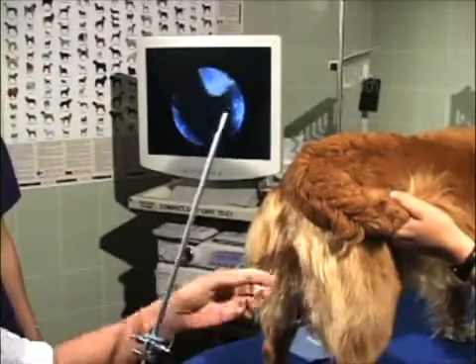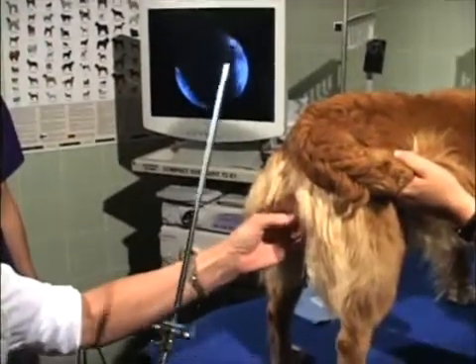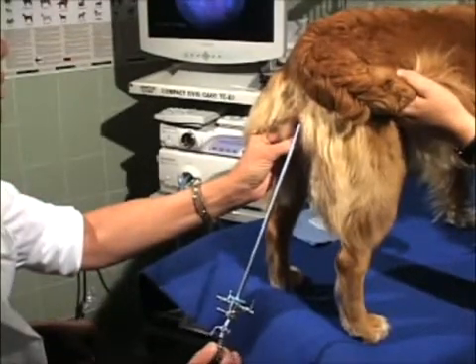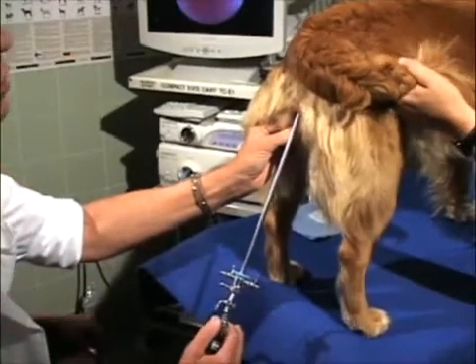Lubrication is generally not needed in a bitch in estrus, but if used, should be non-spermicidal. Care must be taken to avoid entering the clitoral fossa or urethra.